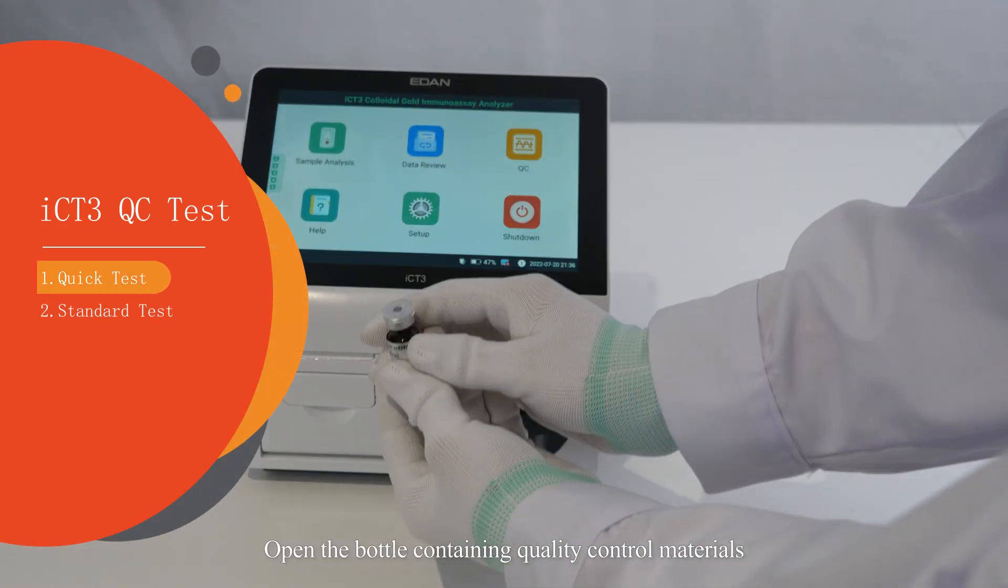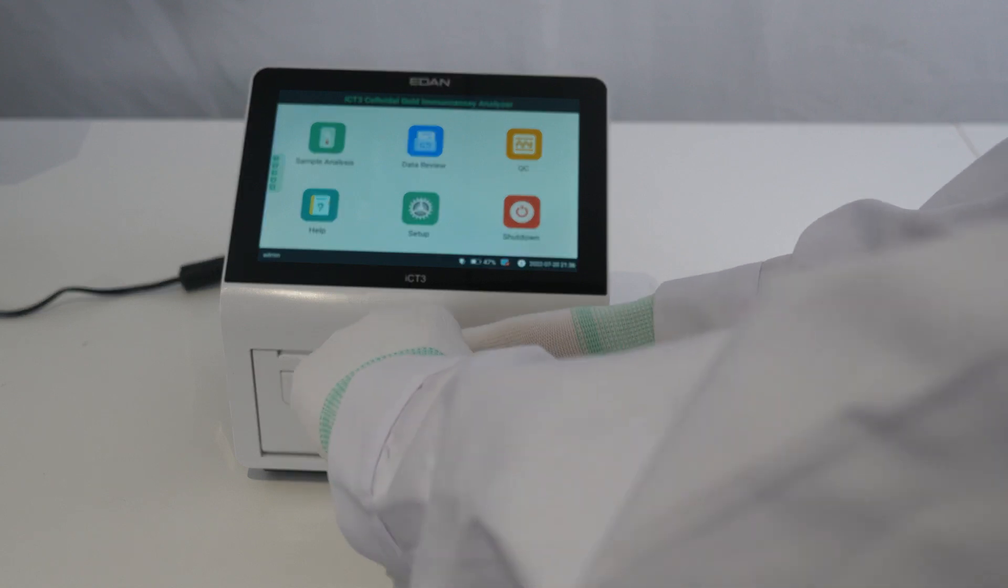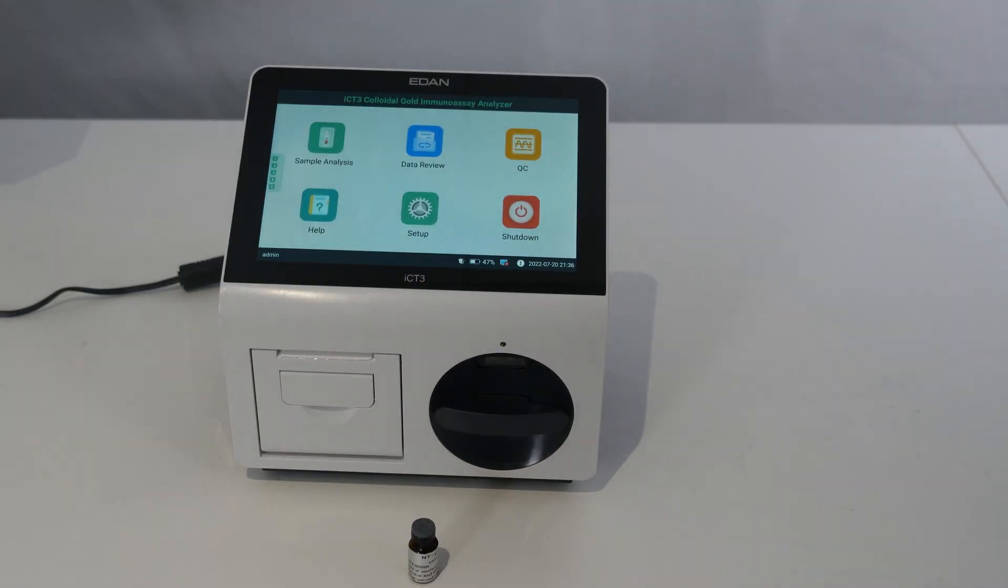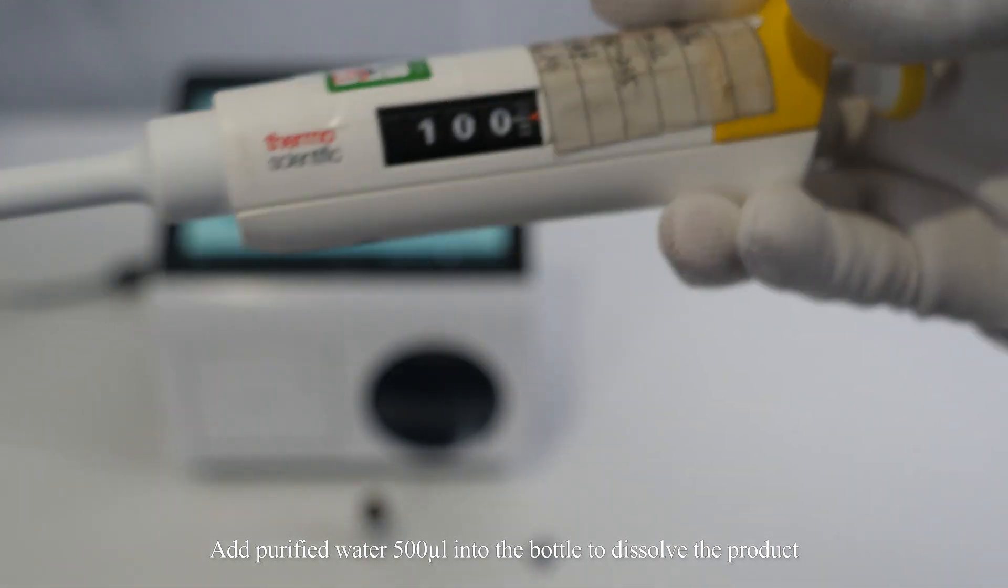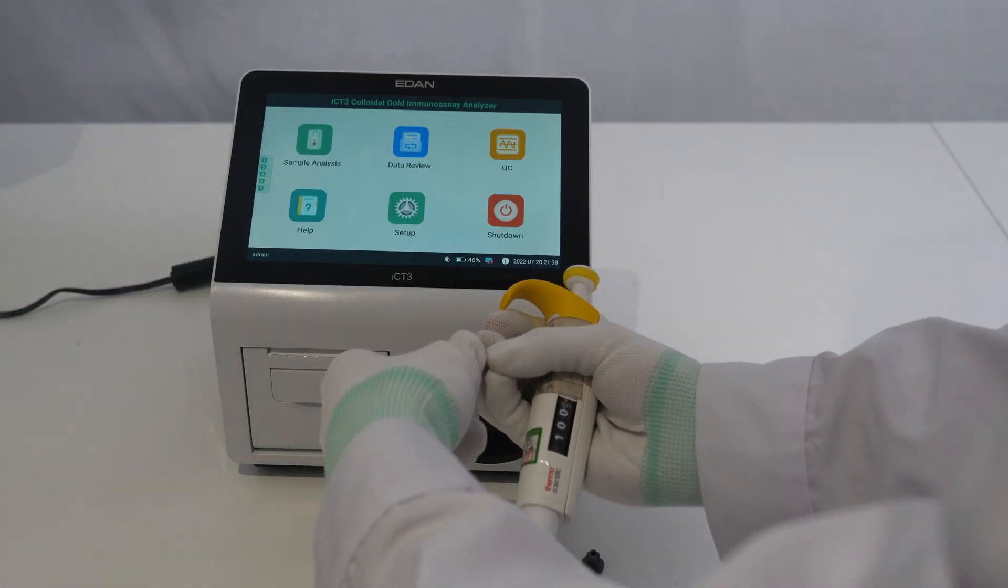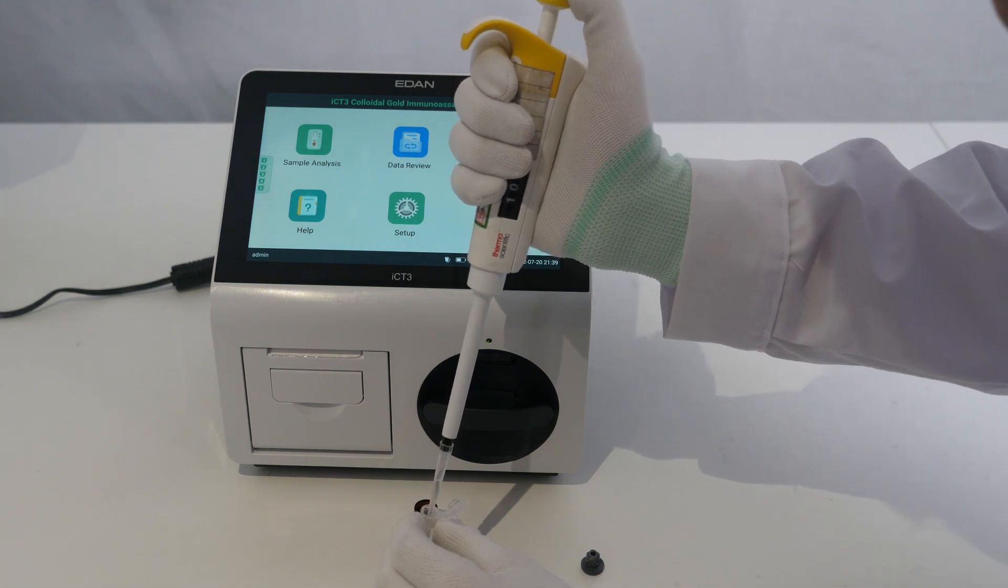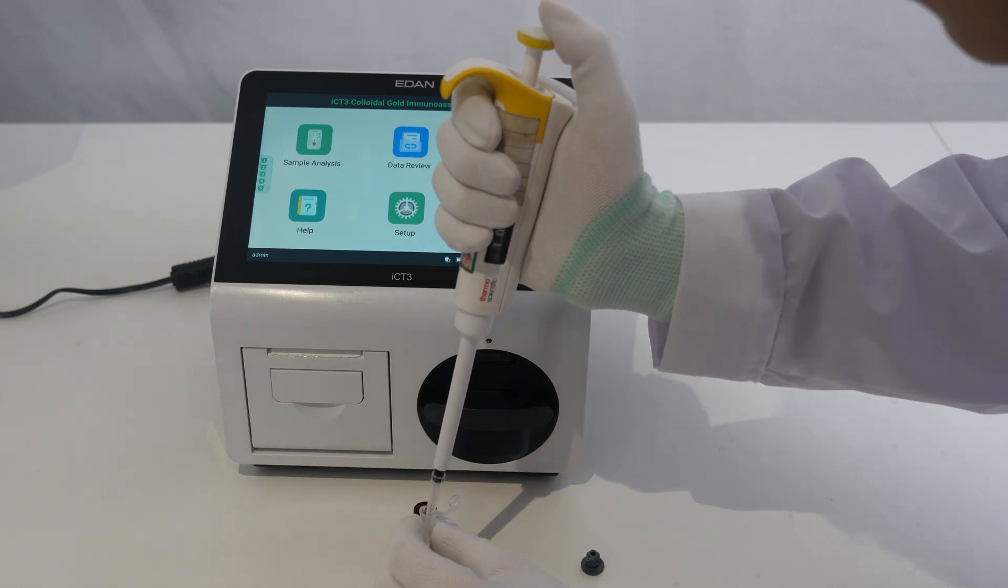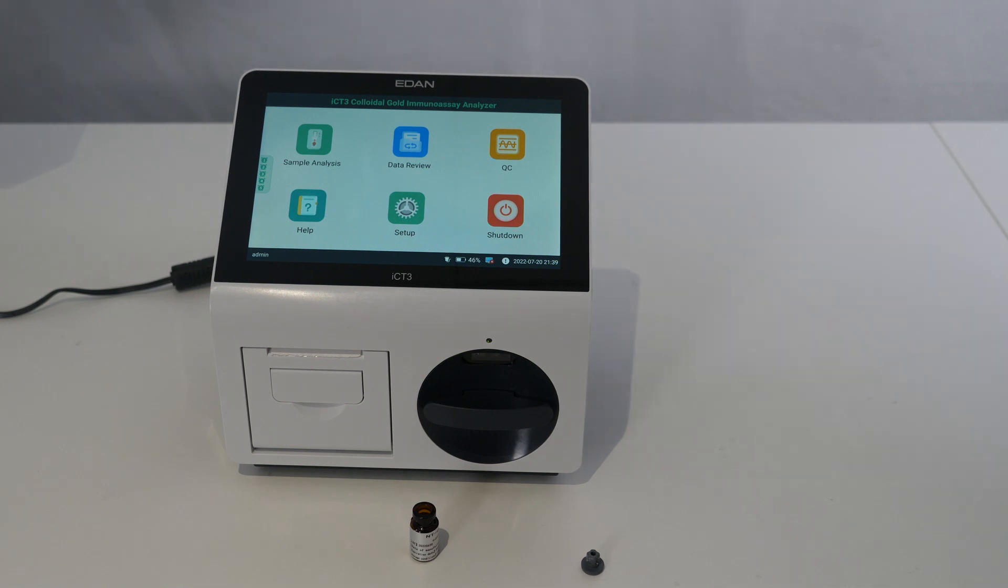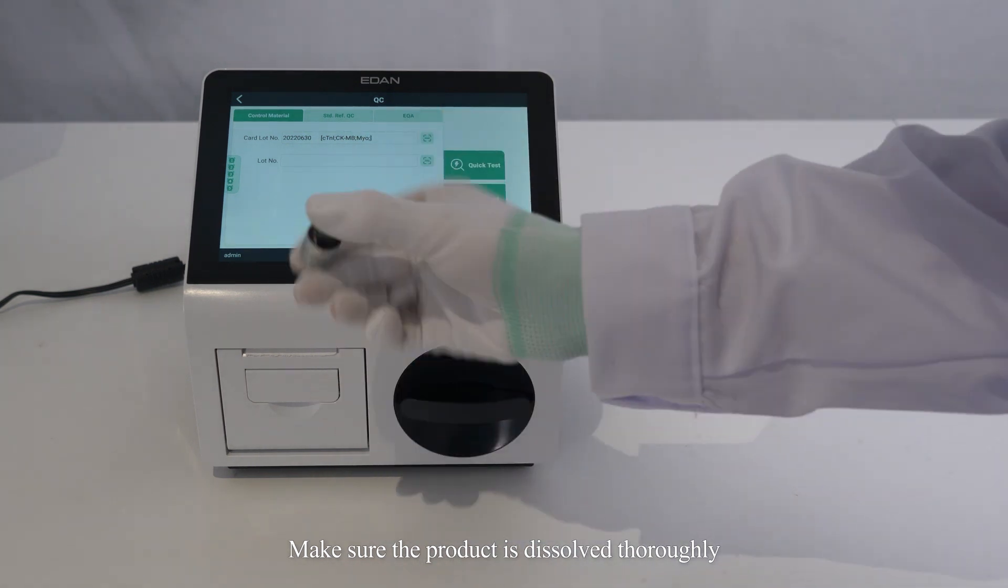Open the bottle containing quality controlled materials. Open the cork. Add purified water 500 microliters into the bottle to dissolve the product. Close the bottle cap and gently mix the bottle upside down. Make sure the product is dissolved thoroughly.